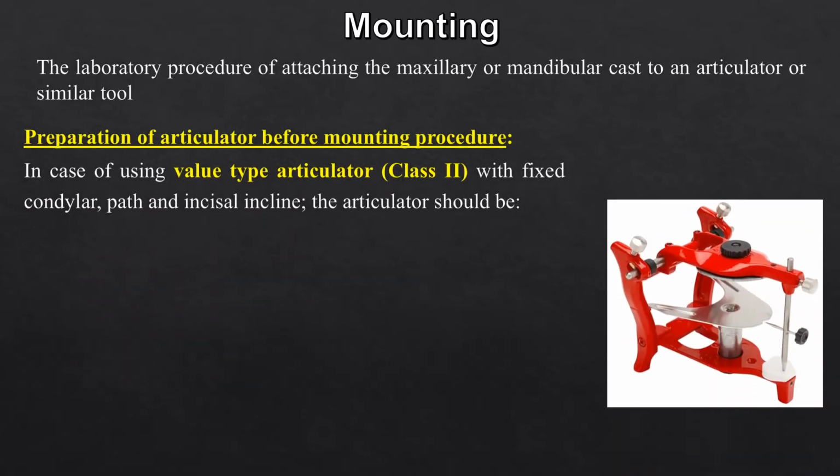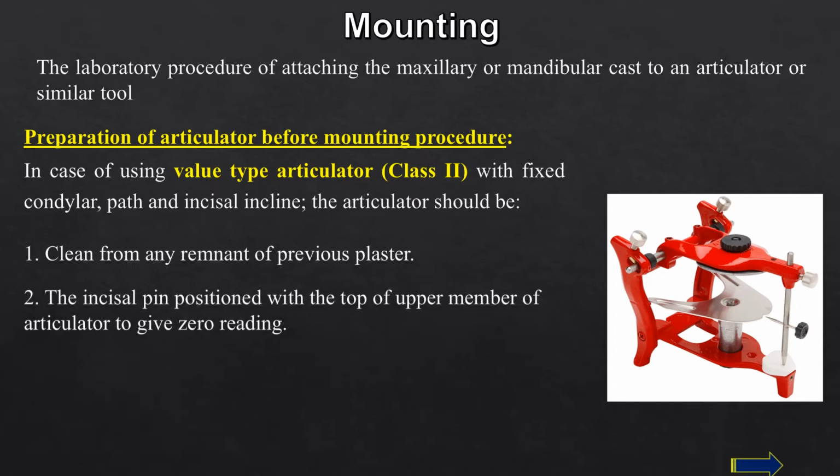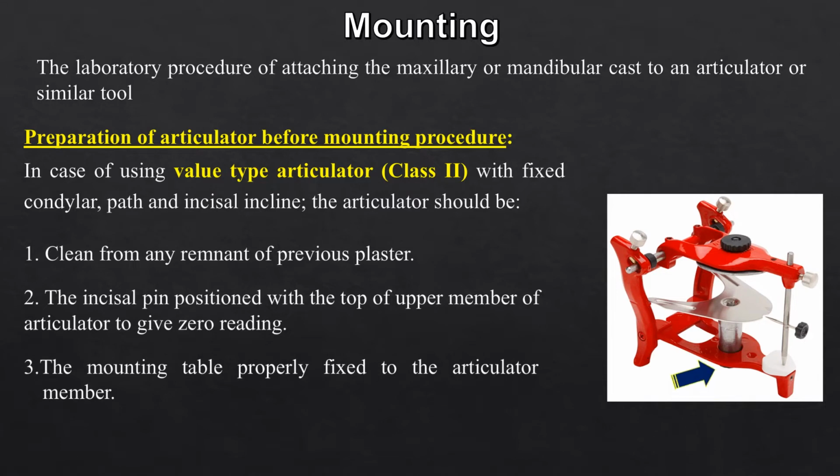Preparation of the articulator before the mounting procedure. In case of using a value type articulator, class 2, with fixed condylar path and incisor guidance, the articulator should be cleaned from any remnant of previous plaster. The incisal pin is positioned with the top of the upper member of the articulator to give zero reading. The mounting table is properly fixed to the articulator member.